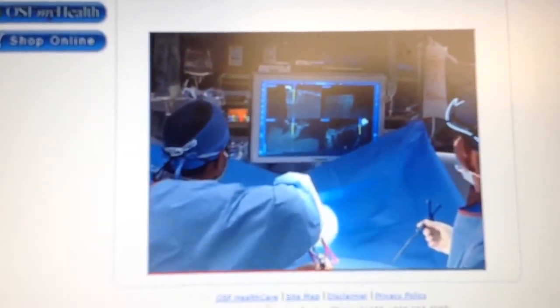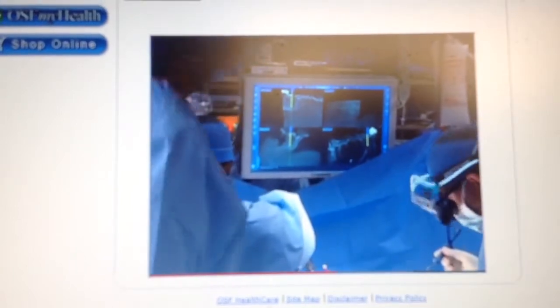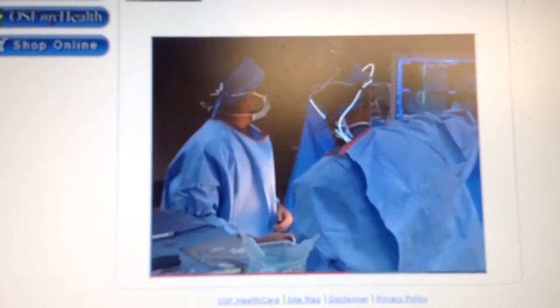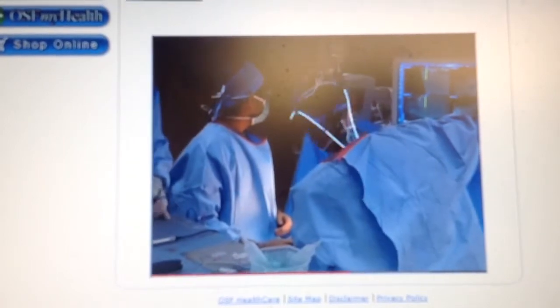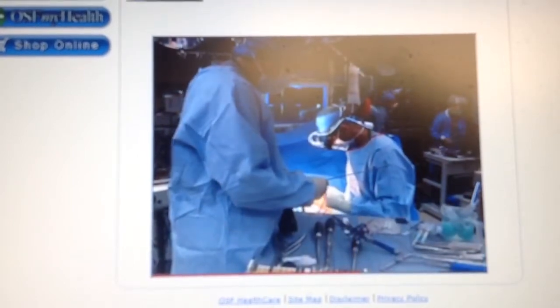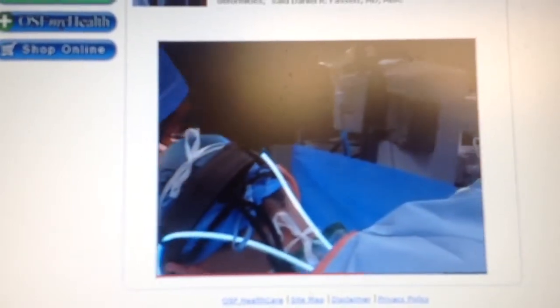The other scenario might be a minimally invasive spine surgery. We're trying to do a surgery through very small incisions. Oftentimes, we're relying on X-ray guidance because you don't see the spine to place your screws or do your decompression. Having three-dimensional imaging allows us to see the spine and maybe perform some of these minimally invasive surgeries safely, more effectively, reducing the duration of surgery.